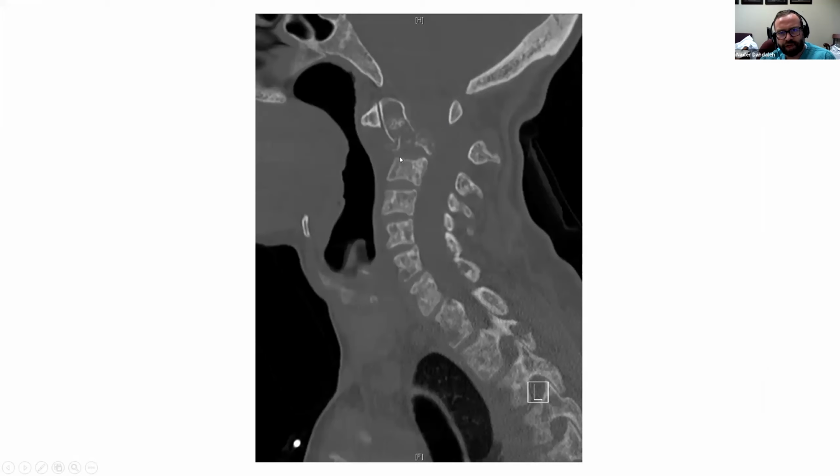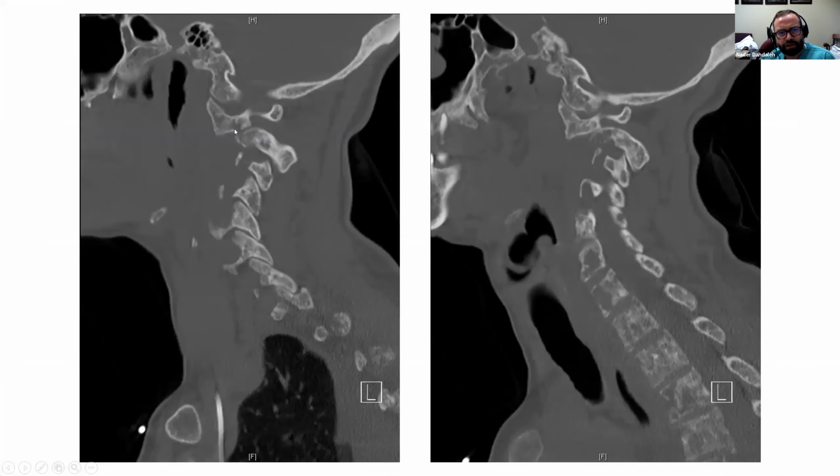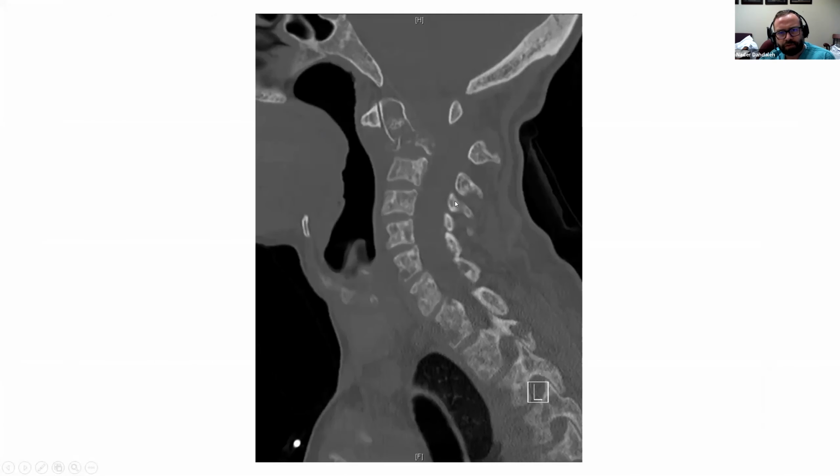So what she has, first of all, the diagnosis: diffuse spinal metastasis, and the index level is this one. She has a pathologic fracture of C2 and subluxation of C1 over C2. So I think you could entertain putting her in traction before surgery as long as OC1 looks okay. There's no significant distraction there. Maybe put her in crown halo, try to get her reduced, take her to the OR and take her maybe C1 down to 4 or 5 or something like that, wherever you have some relatively decent bone stock.